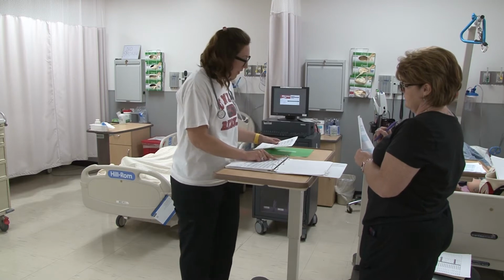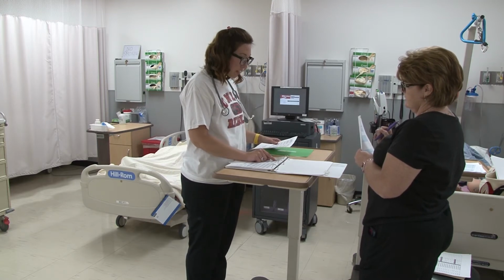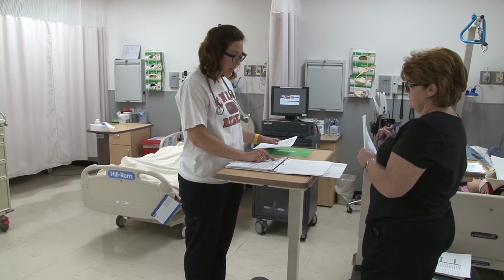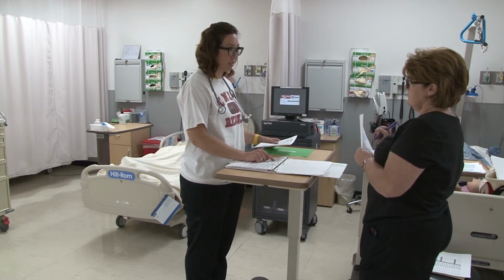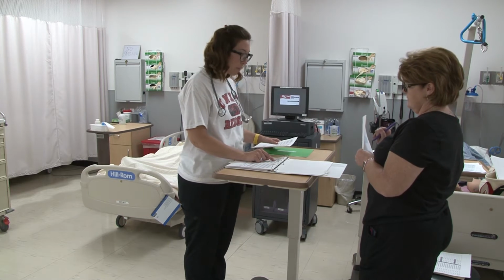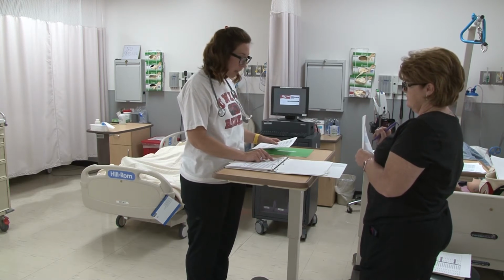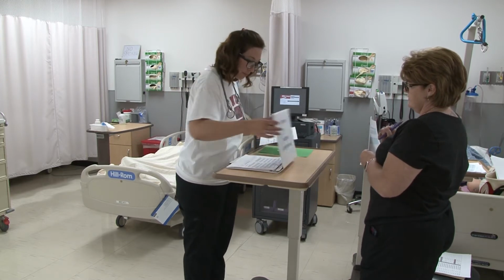Today I'm going to be giving Cardi 60 milligrams via Gtube once per day. Hold for systolic blood pressure less than 100. What's my systolic blood pressure? 144. Okay, so I'm going to go ahead and give it. And I'm also going to be giving Pred 10 milligrams via Gtube twice a day.